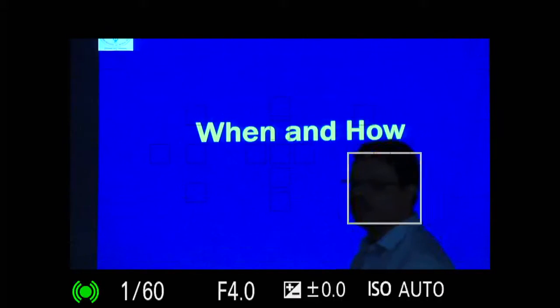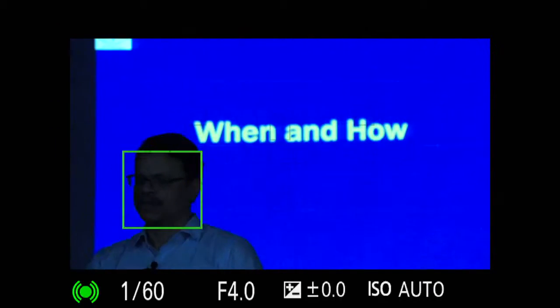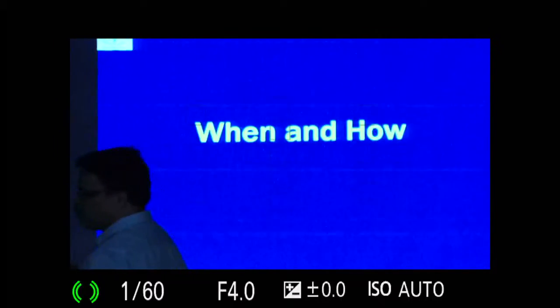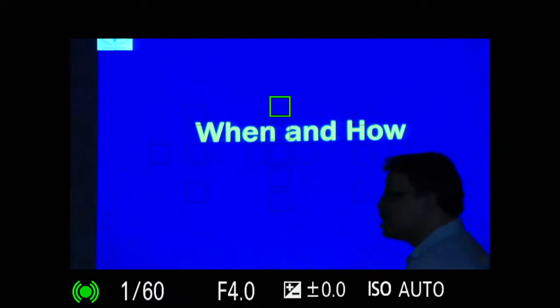The man should be very proficient. You should be proficient in doing ultrasonography and it should be done in very quick time. But when and how, there are many algorithms. People have used only focused echo as the cardiac arrest protocol. What we did as a group, and we published also, was use the physiological interplay, the organ talk between the heart, the lung and the IVC. So, we wanted to find out the conversational problem between the heart, the lung and the IVC.